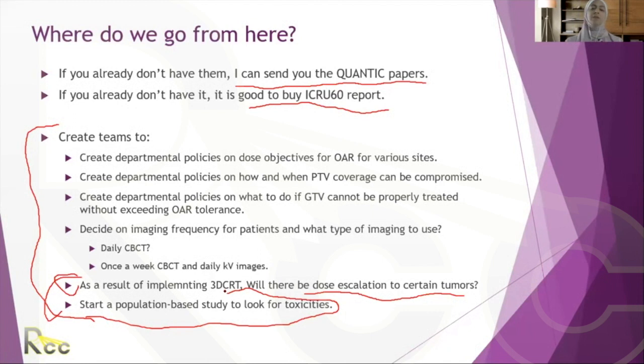So then our breast cancer awareness program, what would you recommend for mammography, baseline mammography or clinical examination? So once you have 3D CRT, there are so many things that you can do. You can improve on your practice and you can do population-based studies. So really it's exciting to start this part of planning. Going from 2D to 3D is really a huge leap. It's a major leap. But inshallah, once you do this successfully, going to the next ones, IMRT or VMAT, the leap becomes much less.